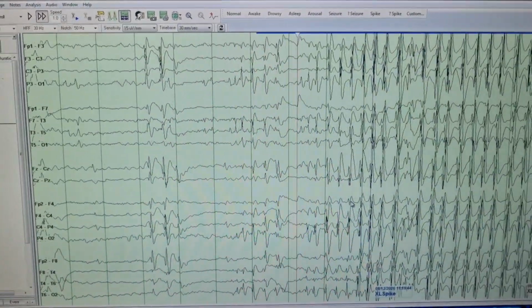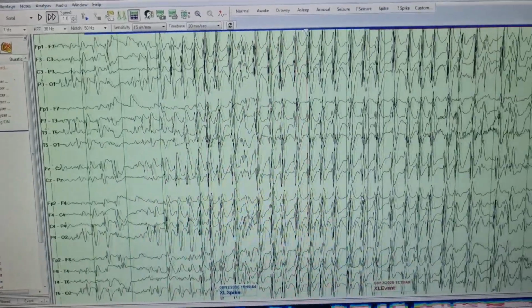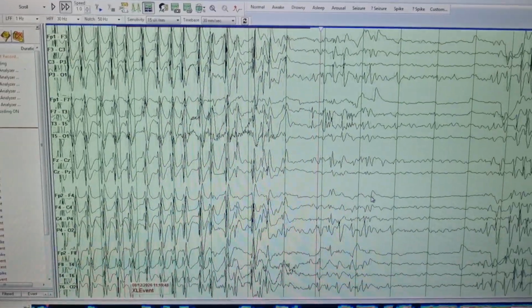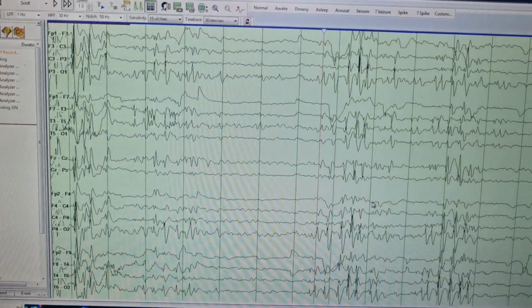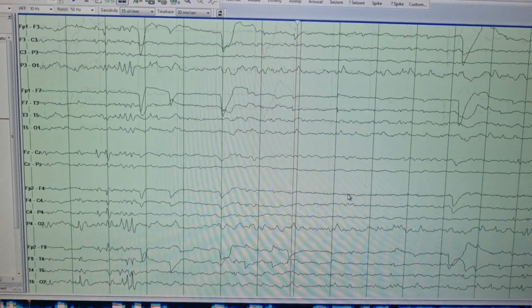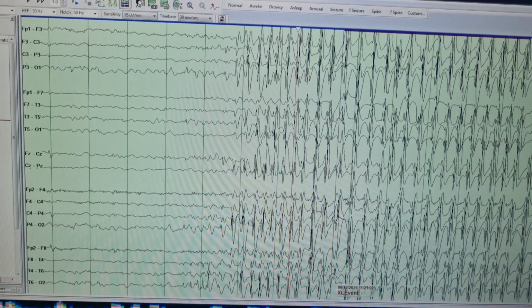Another important thing for non-convulsive status epilepticus is that besides having repeated or continuous electrographic seizures for 10 minutes, or having these electrographic seizures for at least 20% of a 1 hour recording, that is 12 minutes, the child should also have some changes in the sensorium. The child can have altered sensorium, irritability or behavior changes. So that will label the child as non-convulsive status epilepticus. Thank you.